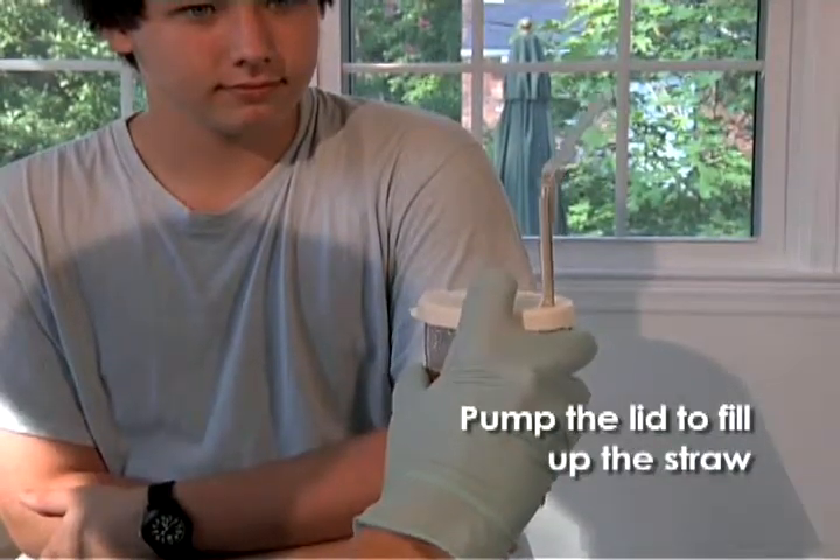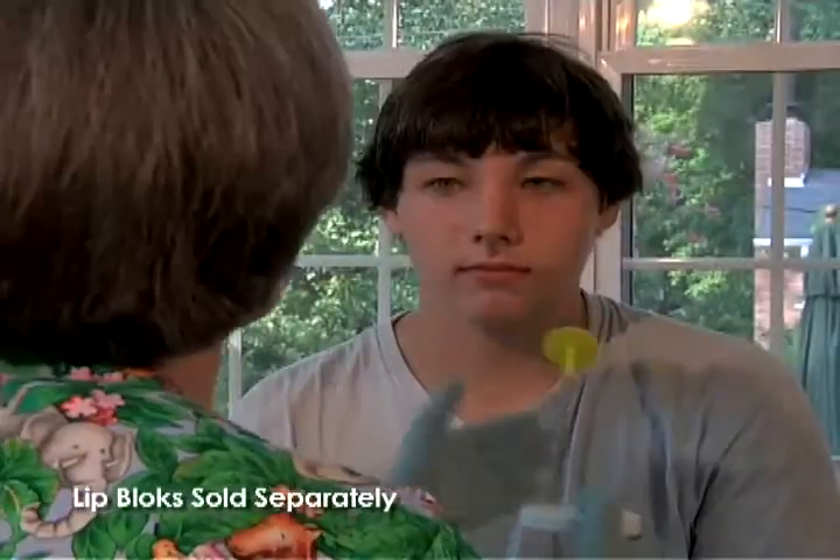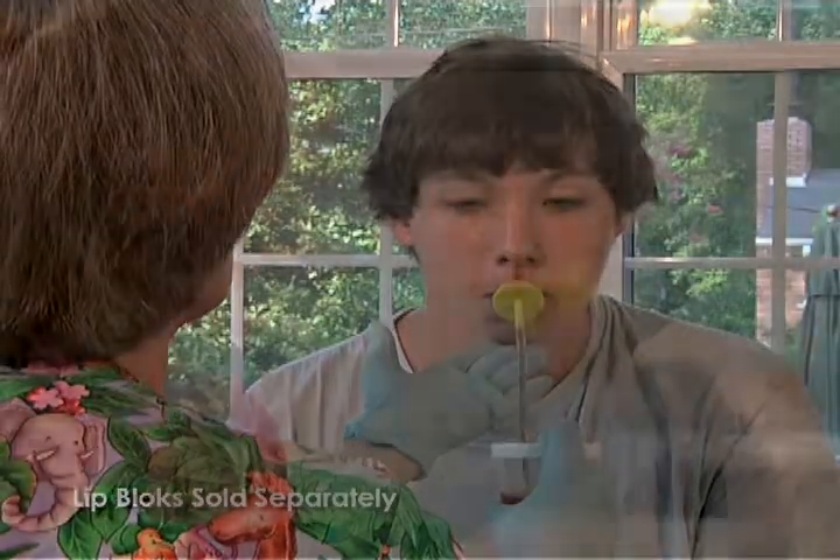An individual can suck from the straw or can be helped by pumping the fluid up the straw with a flexible lid. The Sip Tip can be purchased with either the one-way straws that have a built-in valve, or with the adjustable select flow valve.